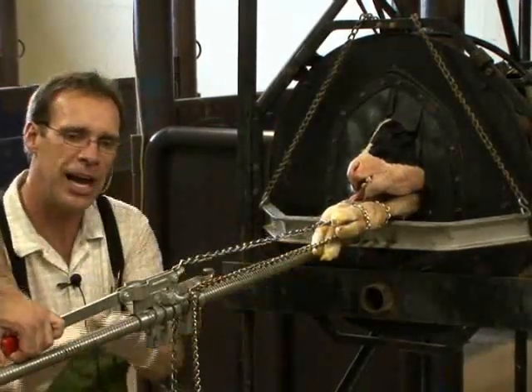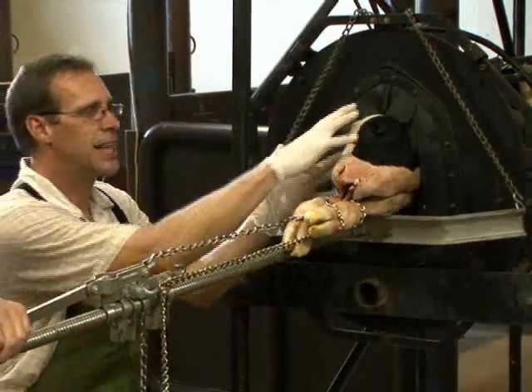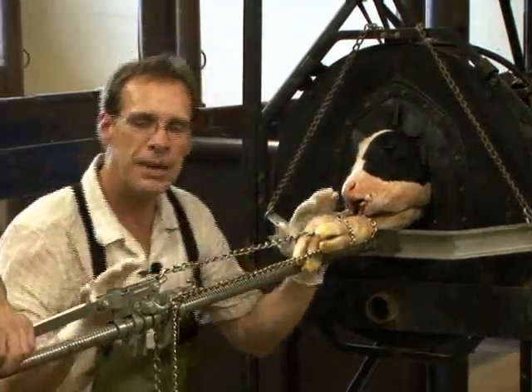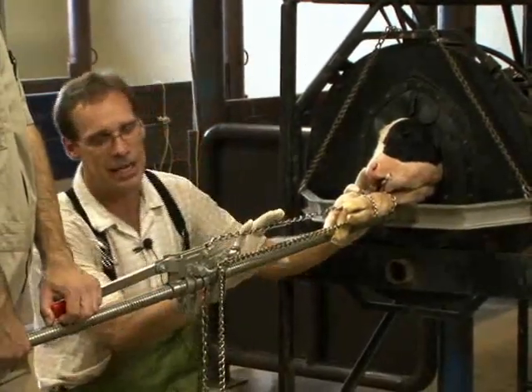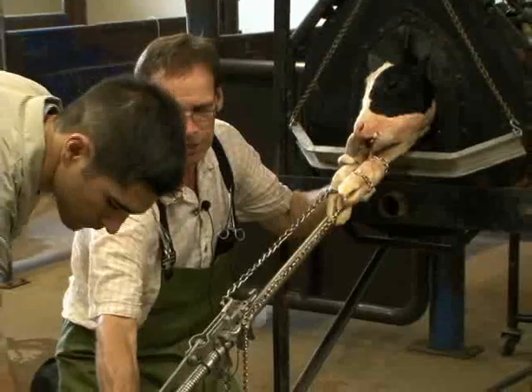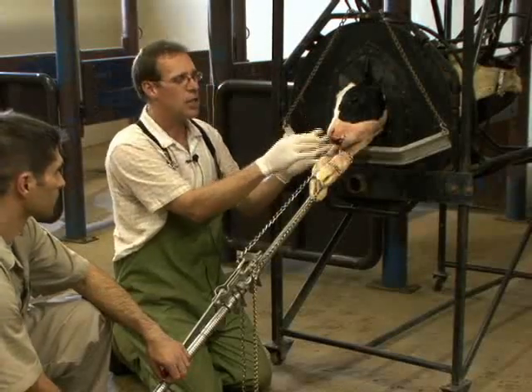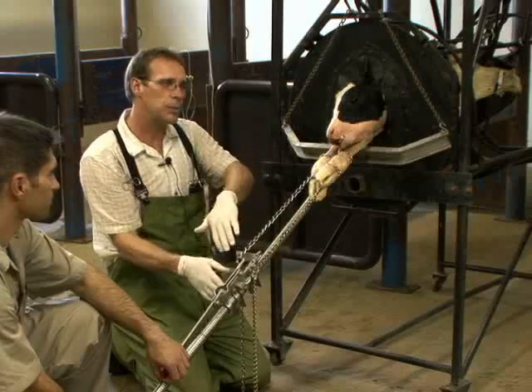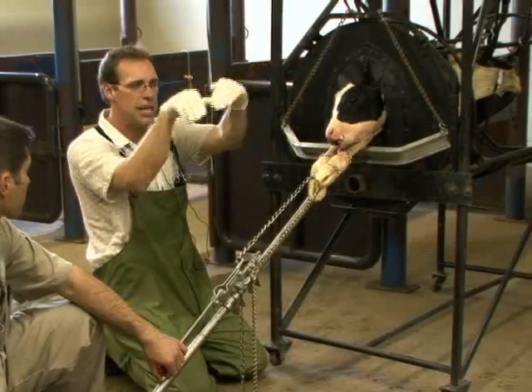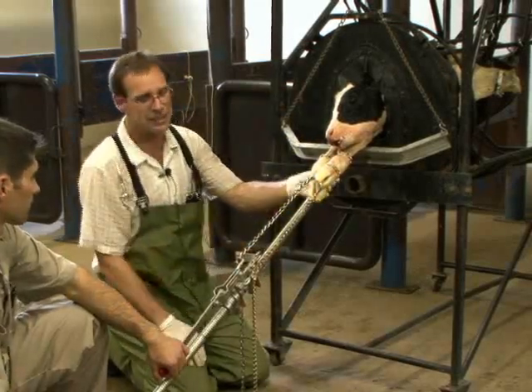Initially we keep the calf jack in a long, horizontal pulling plane and crank. Once the head clears and the shoulder mass is in the birth canal, we may find it very difficult to crank and may need further dilation. To assist with dilation, we can take the end of the long pole down to the ground. This brings more of the calf out through the vulva and also creates the normal arc we prefer for delivery. The calf generally travels from deep within the abdomen, up over the peak of the pelvic entry, and then back down to the ground — that is the normal arc. We want the calf jack to assist in creating that arc.